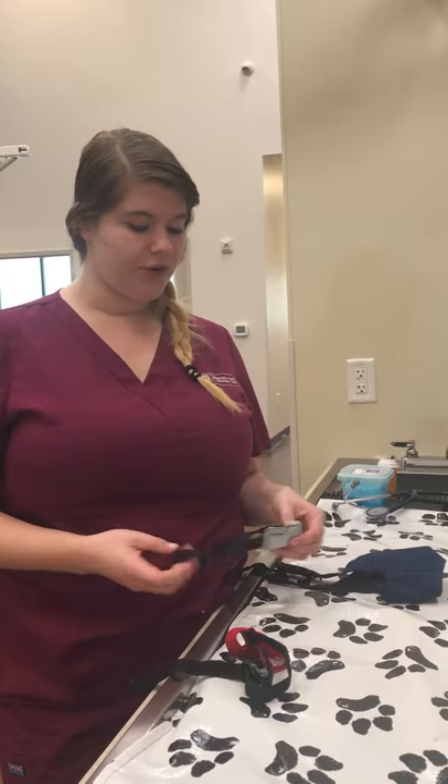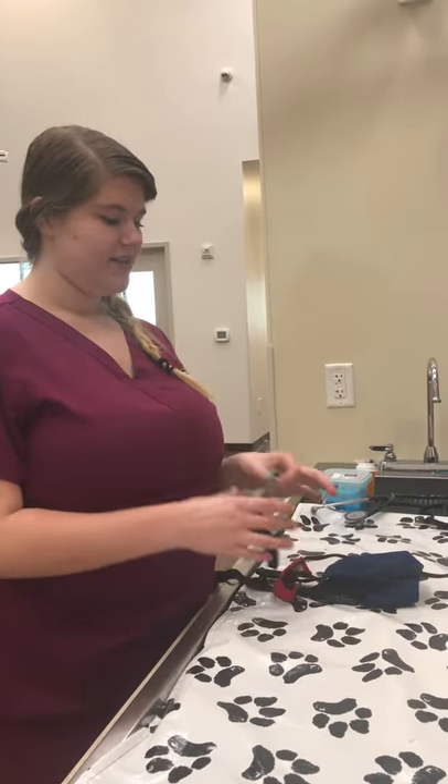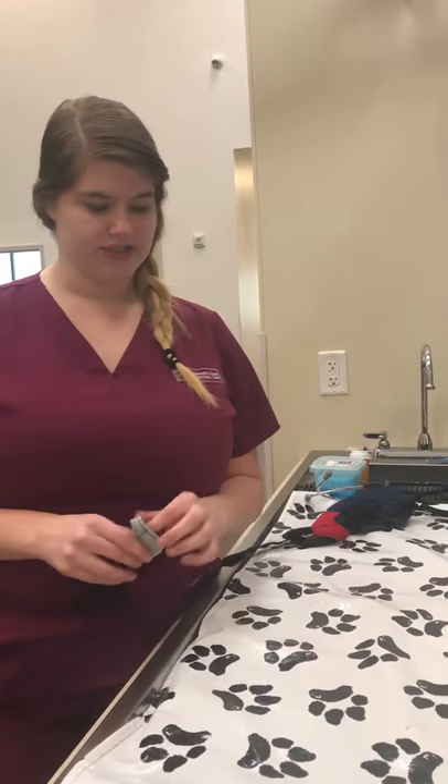This is task 12: applying a nylon muzzle. First, we need to pick the appropriate size muzzle — I think this one will be the right size for this patient.